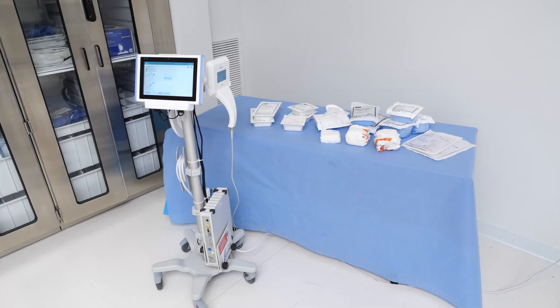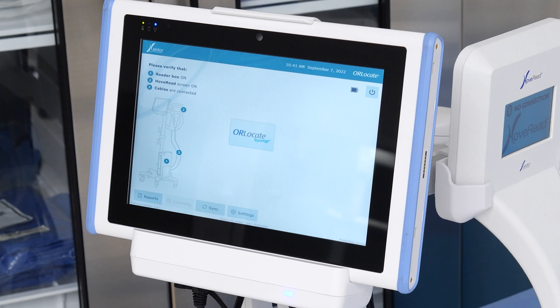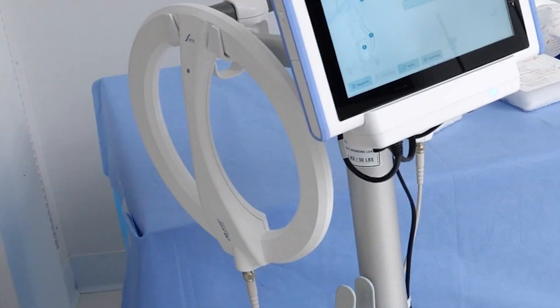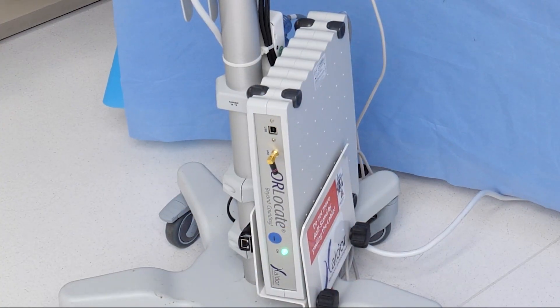The system is comprised of two components: the hardware and the surgical sponges. The hardware components include the panel PC, which is the user interface; the Huvread, which is used to count in and out sponges; a locator wand that is used to locate a missing sponge in the trash, linen, or patient; and the reader box, which provides communication between the panel PC, Huvread, and locator.